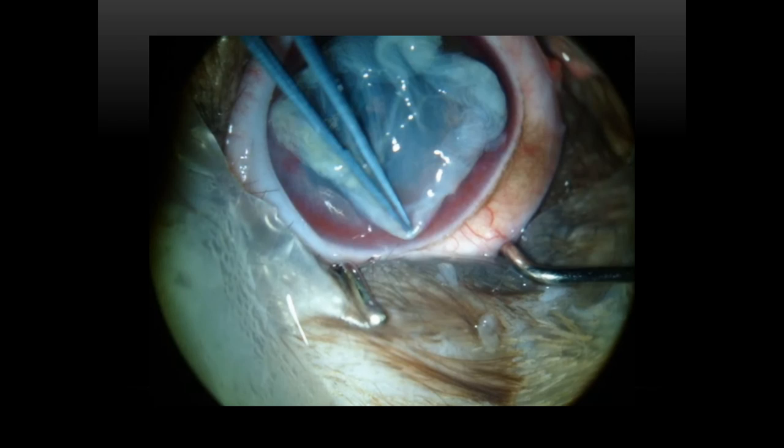If you're using amniotic membranes from female dogs, you'd better do 2 or 3 layers because they are very thin. If you are lucky to have amniotic membranes from large animals, you can use only 1 layer, okay? So the good thing about this procedure is that you don't have to suture and anchor the graft in the cornea. You can anchor the graft around the bulbar conjunctiva, okay? So let's watch it.